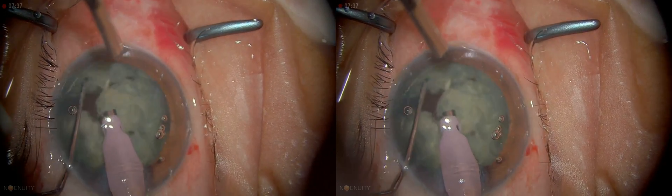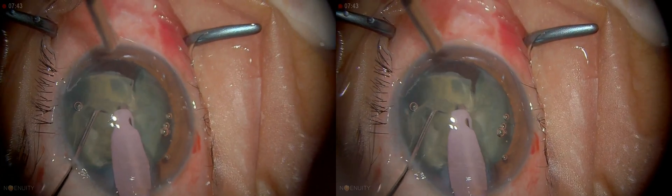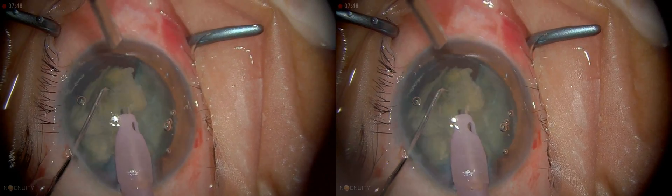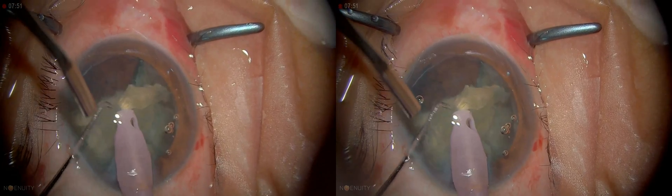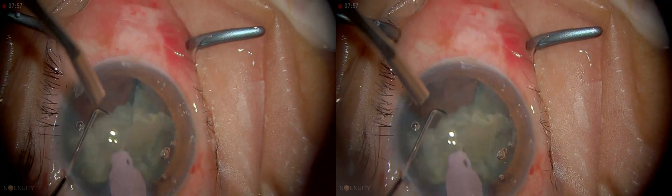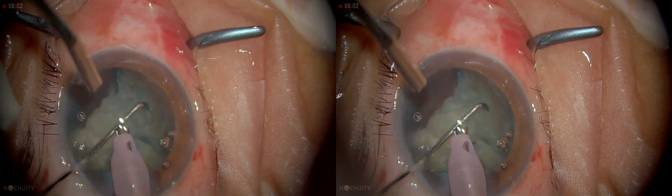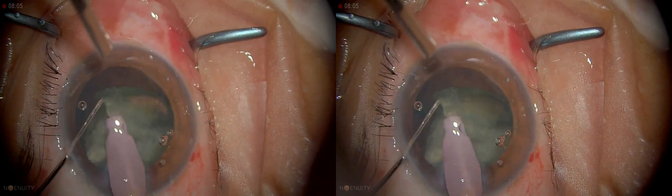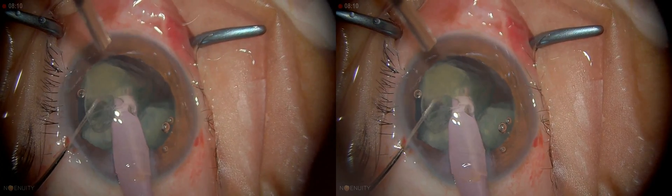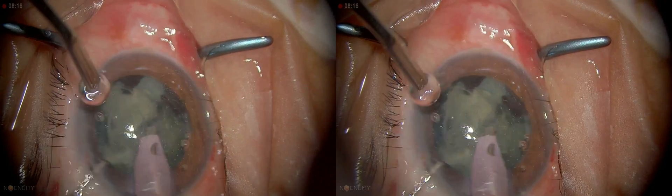So I'm just going to leave that largest quadrant alone and go in and take a smaller one out first. It doesn't really matter for this case, but in some circumstances it may be important not to stress the capsule too much. The density is more — especially the central density is quite high — so they don't get chewed up that easily. I need to apply a fair amount of energy.